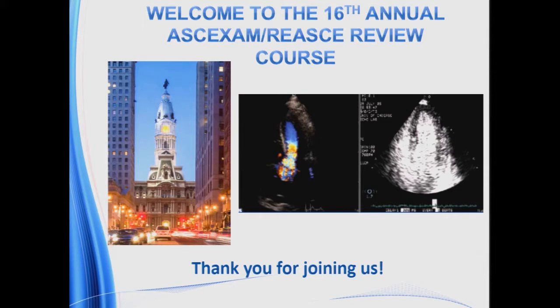Second question. Can you please show us again what a leading edge to trailing edge is? Can we go back to like the third slide in my presentation?